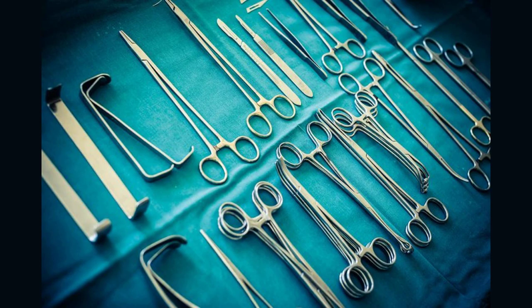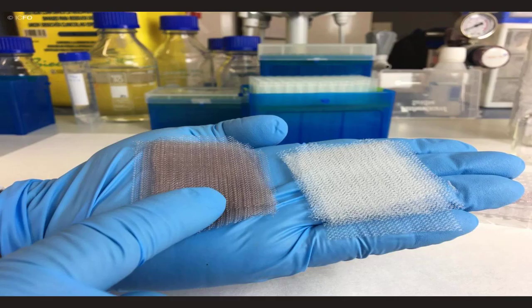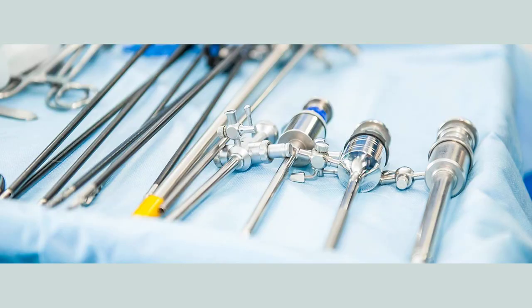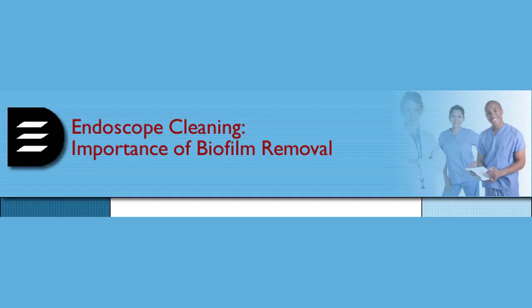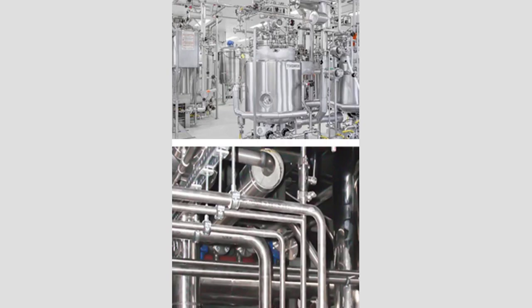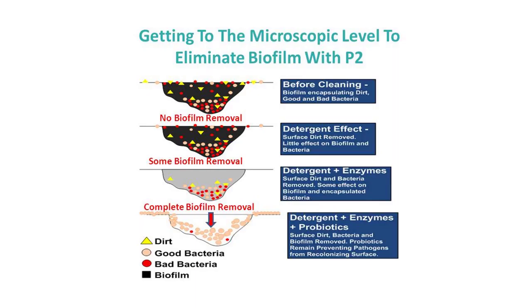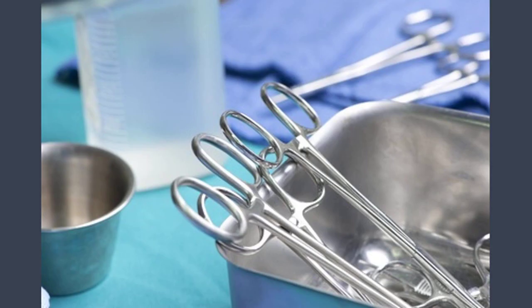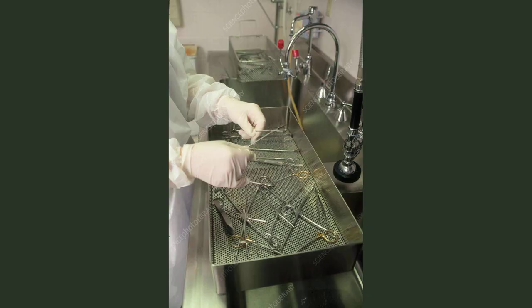The material makes it stick to a surface to protect itself while replicating. It quickly grows, forms microcolonies and tries to spread. Biofilm often attaches itself to surgical instruments, sticking to their surfaces with a glue-like consistency. It's not the most appealing visual, but it's accurate. While it may seem harmless to someone who doesn't know any better, it has posed a significant issue for the medical industry. In fact, they contribute to millions of deaths every year.